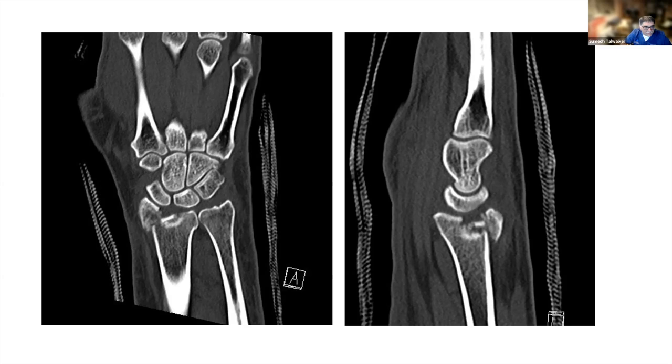And in these situations, these are one of the few fractures where I would probably consider going fragment specific and going from the back. Remember, if you wanted to reconstruct your radial pillar, you can release the entire brachioradialis dorsally or volarly. I'm more than happy to go dorsally to release the whole brachioradialis. Get the radial styloid down, then get into the joint, raise everything up, and then put an L-shaped plate on the ulna side. So I'm reasonably pleased that the sigmoid notch is not affected on these two cuts.